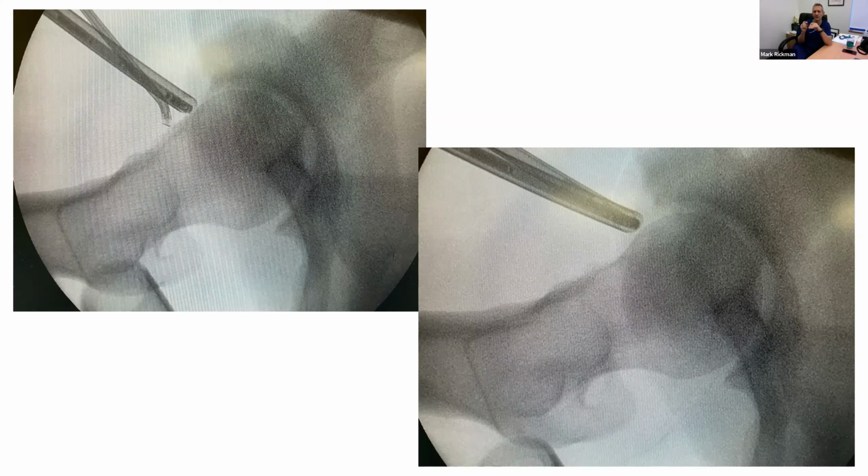The labrum's by the by. You can fix the labrum. If you have to, you can do a labral sort of not transplant, but reconstruction and reconstitute labral tissue. That's not the end of the world. But when you see the articular cartilage is peeled off and is trashed, it's really disappointing, and there's just not much you can do about that. People are trying. You can microfracture the acetabular surface, but it's hard. And the results are not great, and people are trying glue and like fibrin glue to try and get it to stick back on, but there's not yet any really good results for the articular damage that you see.